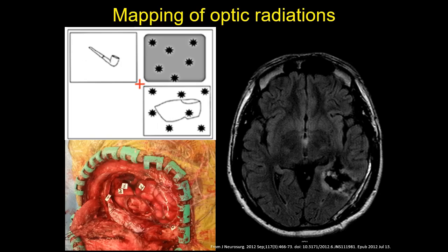To this end, we employ a variation of the picture naming paradigm where two pictures are presented opposite one another, and this is alternated with each stimulation. Utilizing this task, we are able to achieve a reasonable resection as demonstrated in postoperative FLAIR imaging, and the patient only experienced a superior quadrantanopsia with preservation of the inferior quadrant.